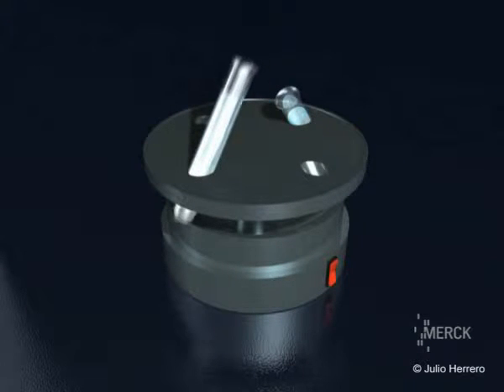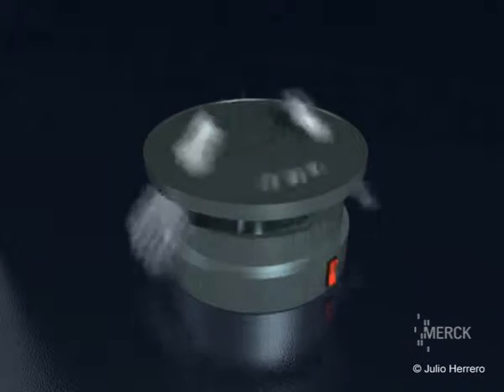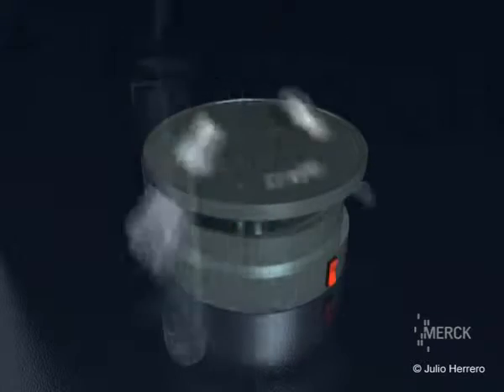Parallel to this, semen obtained through masturbation is prepared, separating the mobile from the immobile sperm and then concentrating them.